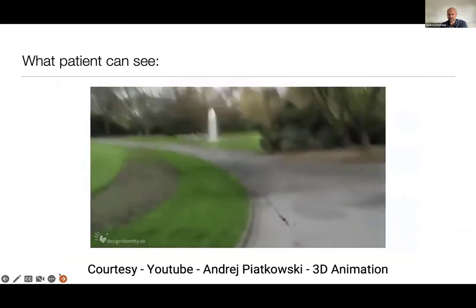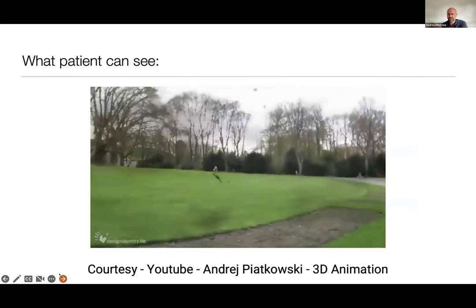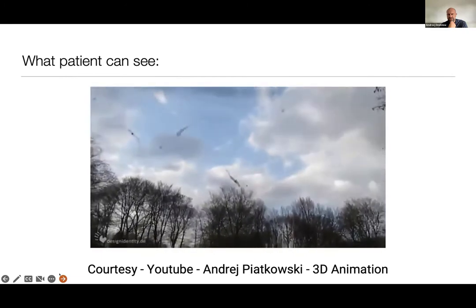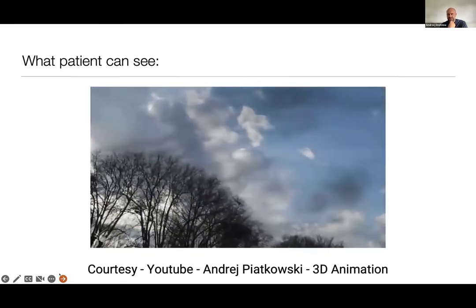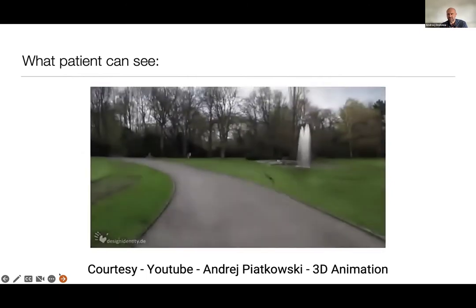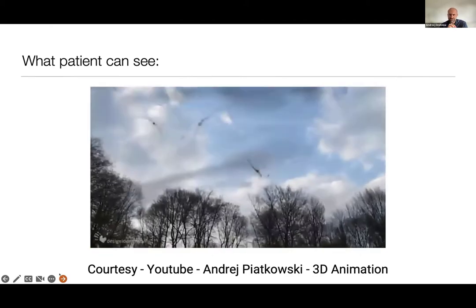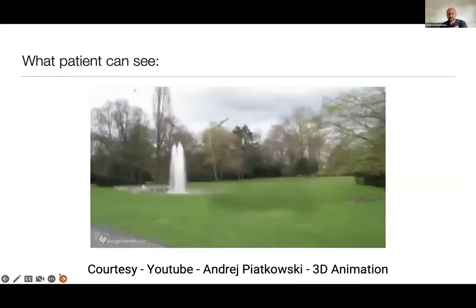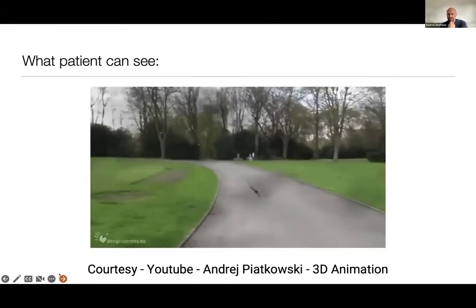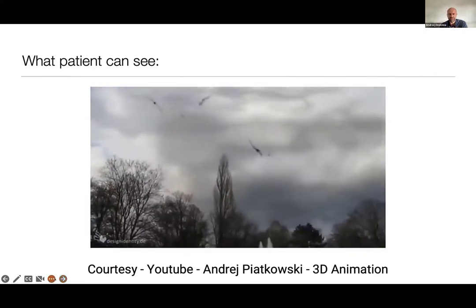But generally, even if the majority of our patients are trying to explain to us how it really works with the way they see floaters, in many cases, it's really hard for us to visualize them, because fundoscopy doesn't really tell us in many cases what's the location of floaters, especially in young patients, where we just see very, very transparent small floaters, which for many of them are really a big diagnostic problem, and the problem from the point of view of their perception.